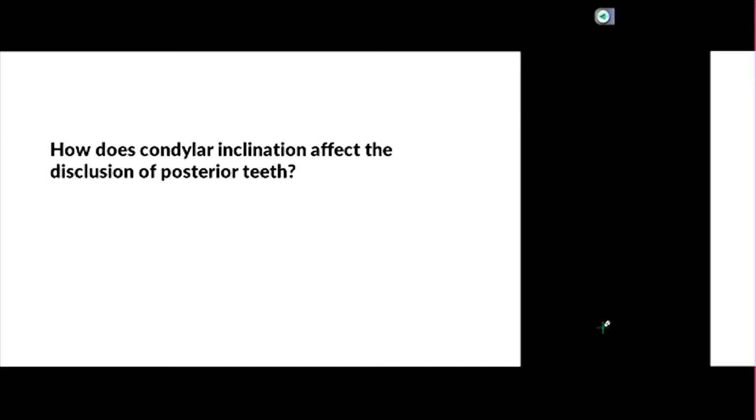The latch in the back, if you unhook that, allows you to slide your lower jaw forward. Really, you're moving the top member forward, but it's simulating a protrusive movement. So your lower teeth are sliding forward. Everybody do that, the latch in the very back here. Is everybody able to unlatch theirs and slide theirs forward? Okay.